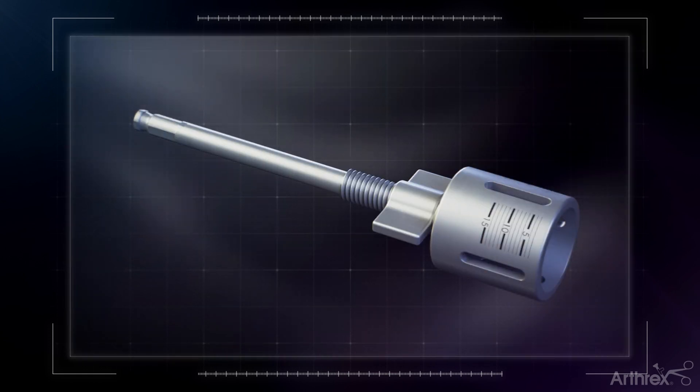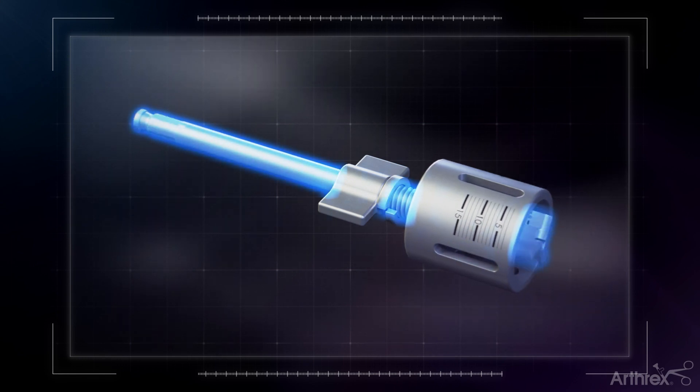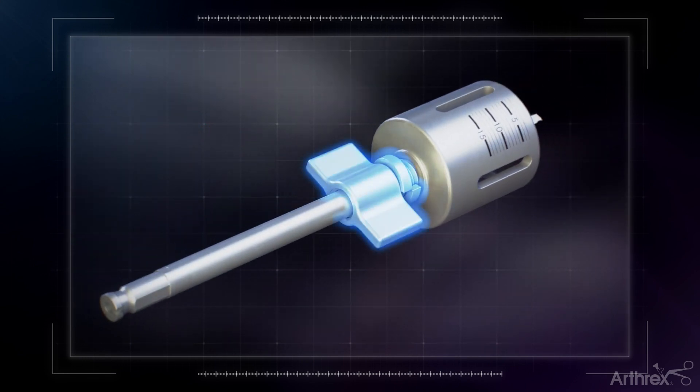Select the appropriate recipient site reamer and loosen the wing nut. Advance the reamer to the desired depth of the recipient site and secure the wing nut.